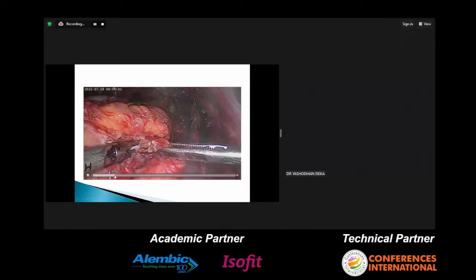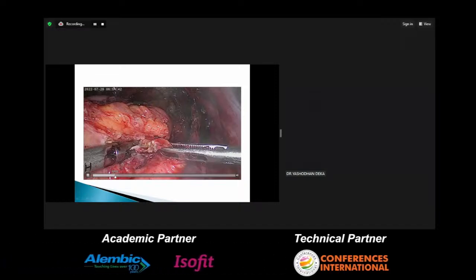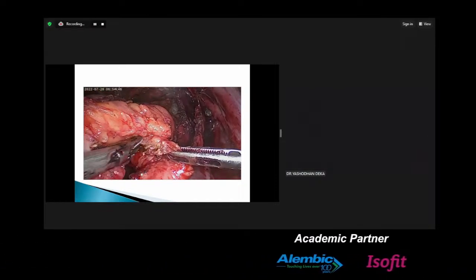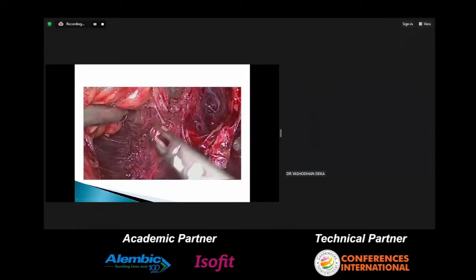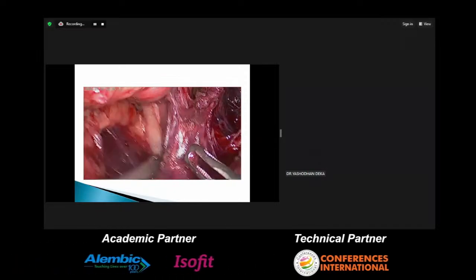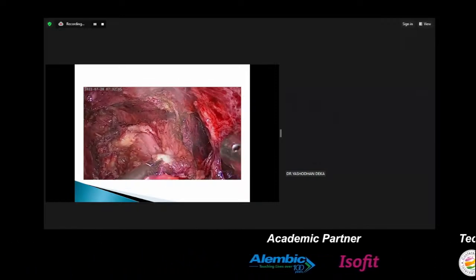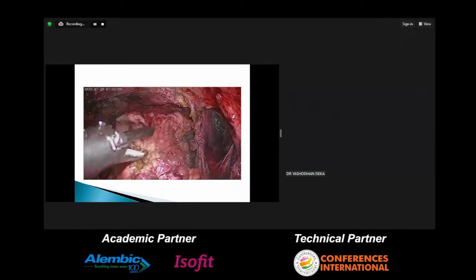So what is important is that after you defat, even if you're prepared for a discoid, sometimes you never know situations like this where you have to convert a discoid to a segmental resection. So whenever you counsel a patient for discoid, you should also be prepared for segmental, because in this particular case, the lesion was small, but it was subocclusive because we could not pass the circular stapler through it. So intraop, you have to convert it to a segmental.